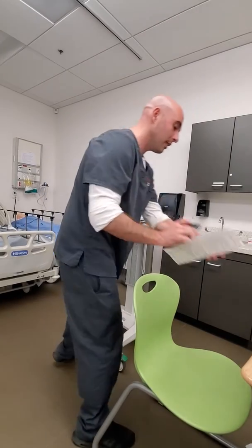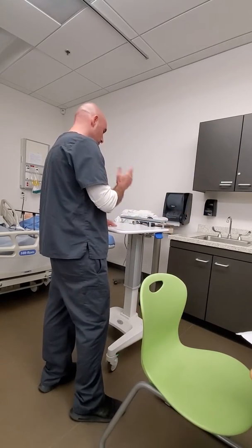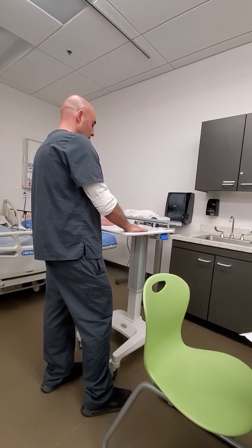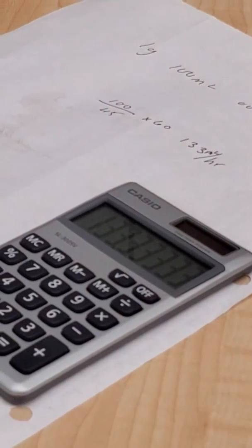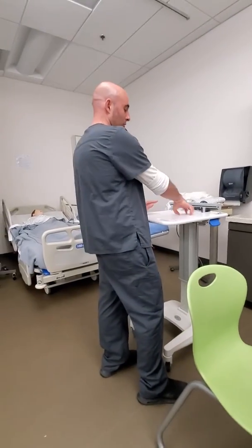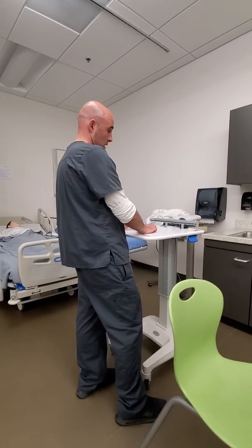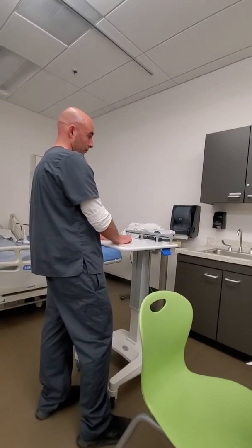So now I know my infusion rate and I know the drug that I have. I'm going to look on the computer to see what was previously hung as the primary line, so I can see if my Ansef will be compatible with my primary solution. No, because there's nothing ordered, because it's a saline lock, so there won't be a maintenance fluid order.